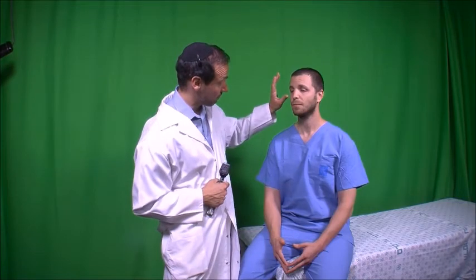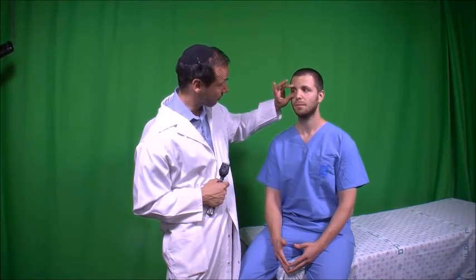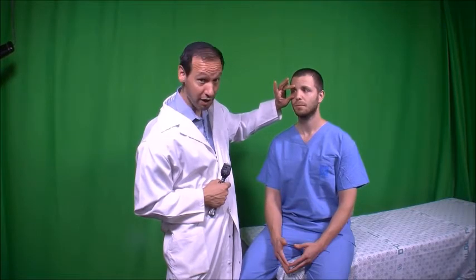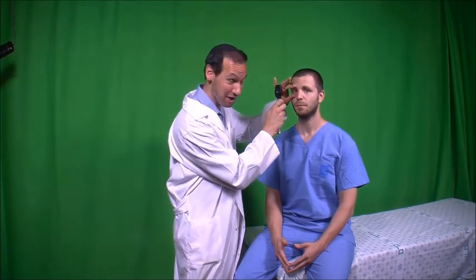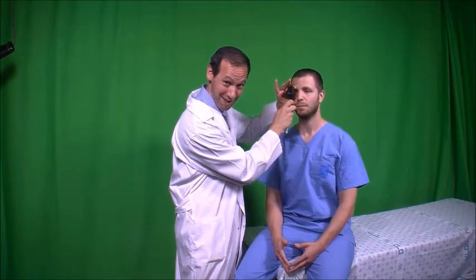The use of your left hand is very important. And what you're going to do is you put your thumb underneath the eye, and then I use my fourth finger or my third finger and put it right on his eyebrow. One of the things that this helps me reassure is that I'm always worried that I might push the direct ophthalmoscope into his eye, and having my finger there I know is blocking me from doing that. I'm extending out my index finger, which is going to make contact and help me stabilize my direct ophthalmoscope.